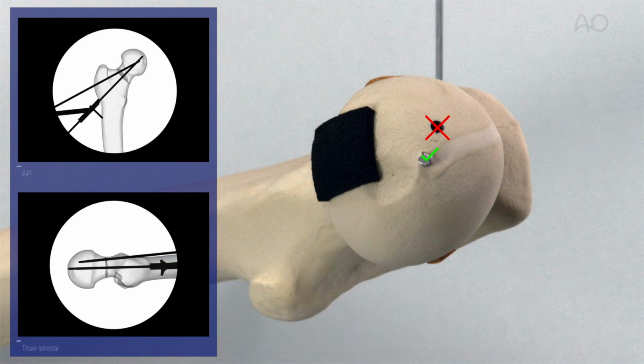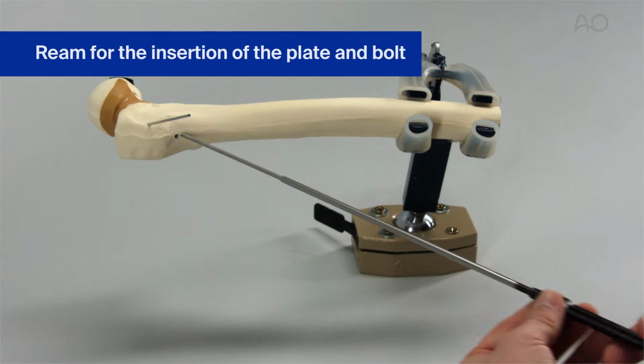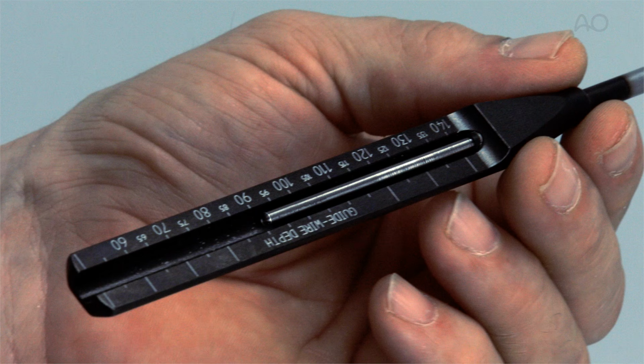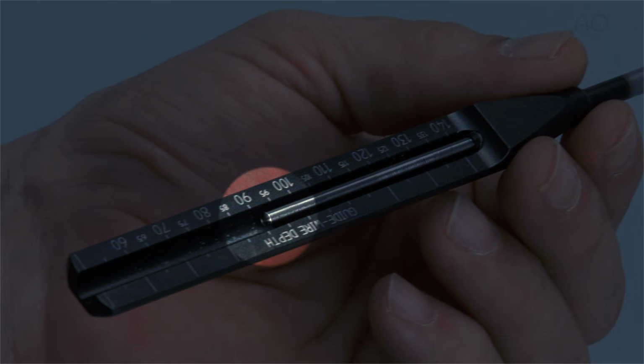The correct angulation and position of the central guide wire are verified under image intensification in both the AP and true lateral planes. The direct measuring device is passed over the central guide wire. 5 mm must be subtracted from the length read from the direct measuring device, and the next shorter FNS construct size is chosen. In this demonstration, the length read from the direct measuring device is 92 mm.